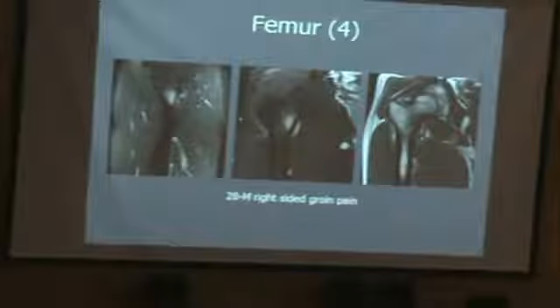He will tell you, I have pain, this pain is recurrent every night, it's new, it's worse at night, and if I take aspirin it kills that pain. What you're going to say probably is osteoid osteoma, and it looks like this, by the way. It's a good location for it, but there is no reaction to the bone in this case.